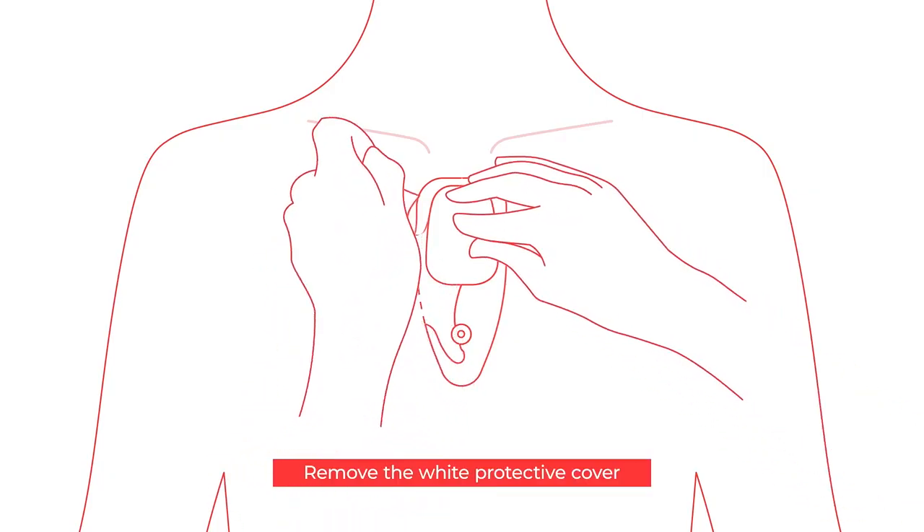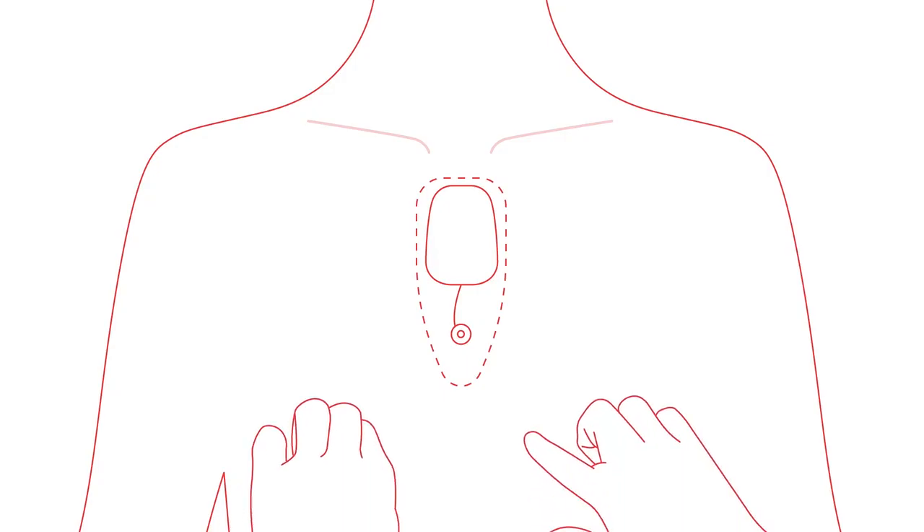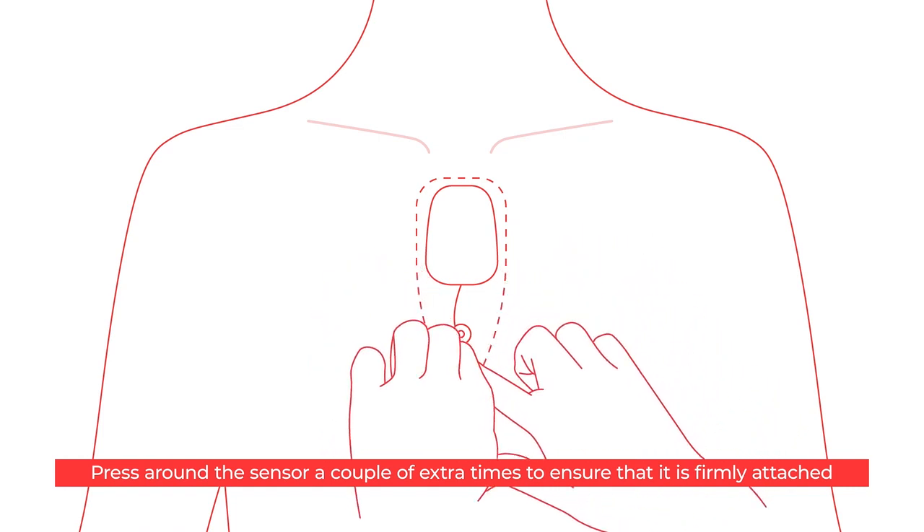Remove the white protective cover. Press around the sensor a couple of extra times to ensure that it is firmly attached.